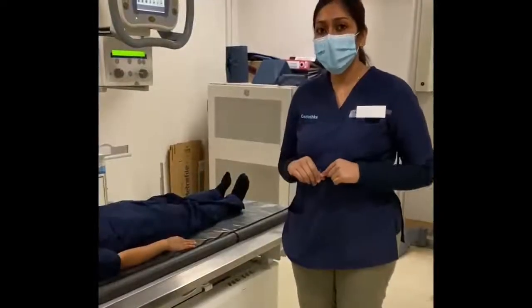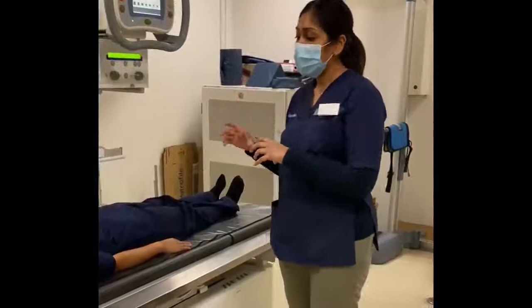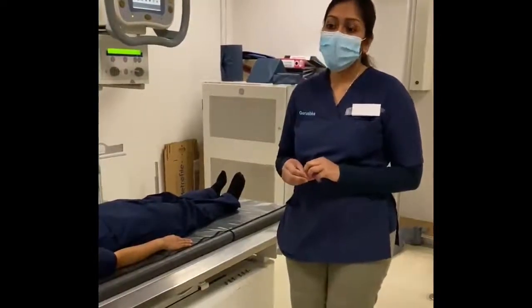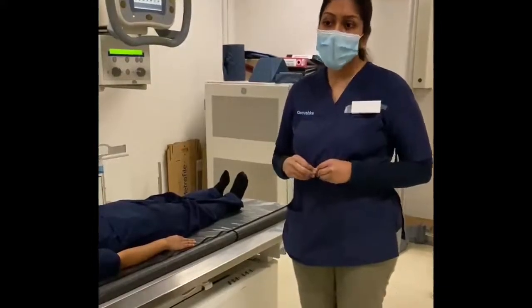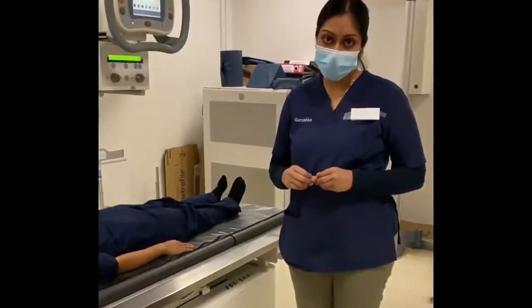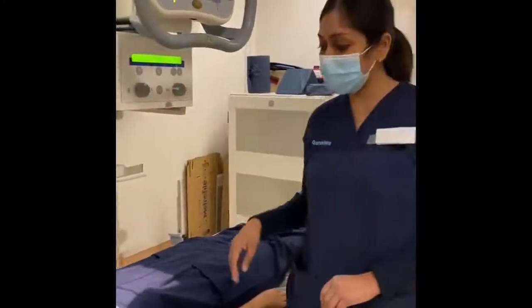For the T-spine X-rays, we need to use a grid. The reason is that the area that we are X-raying is greater than 10 centimeters. It's important for us to use a grid as it reduces the scatter radiation that is caused and improves the image contrast and the image detail. So the direction of our centering ray is the vertical direction.